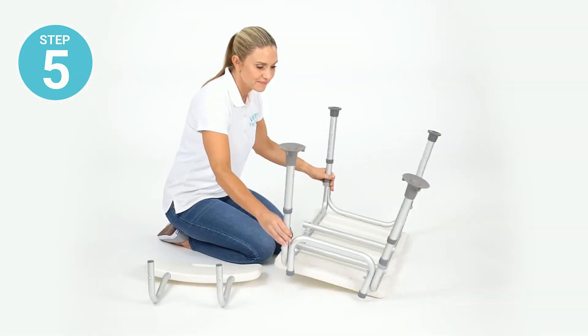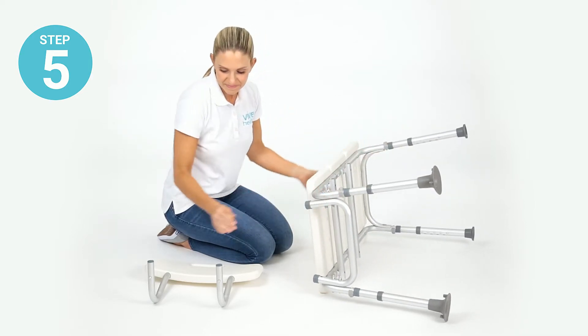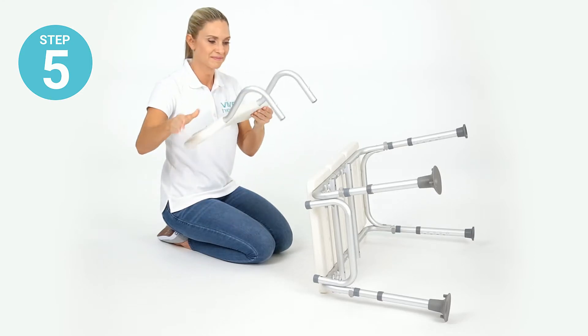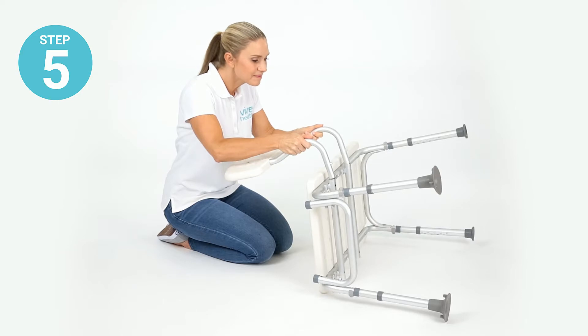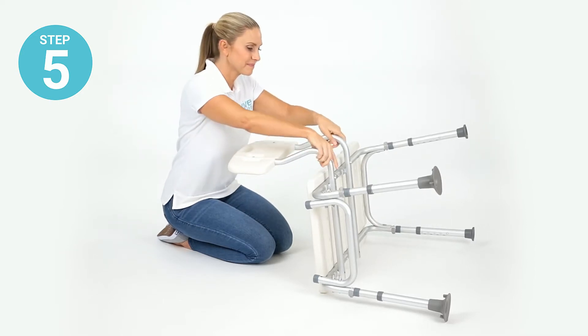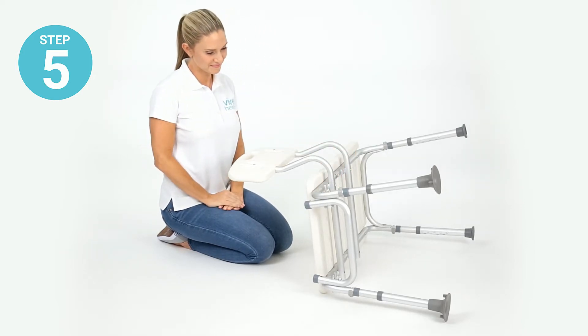Step five: turn the bench onto its side and attach the backrest assembly by fitting the backrest bars into the tubes on the underside of the bench. Next, depress the locking pins to fit it into place. The backrest can be attached on either side depending on the setup of your shower.